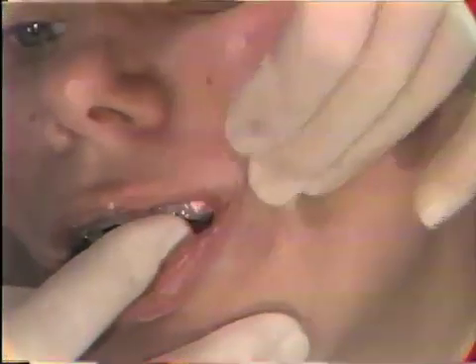It is also possible to take the cheek and on the external surface rub the cheek to make that dressing even more smooth, because the mucosa pressed against it with saliva will make the surface of the dressing material quite smooth.